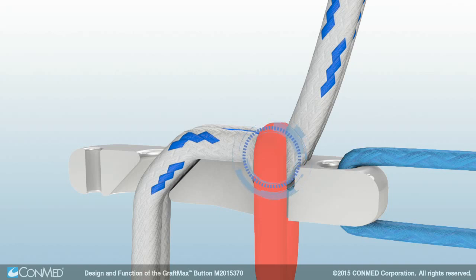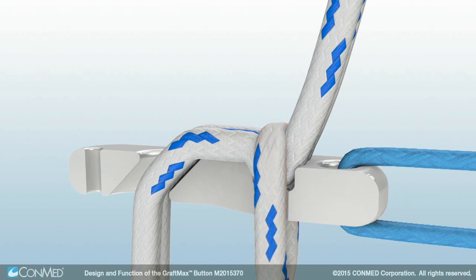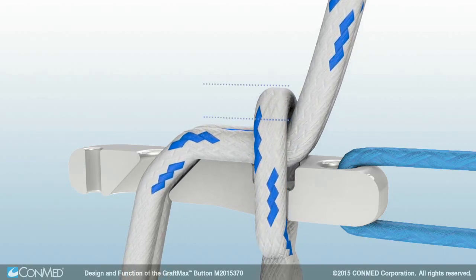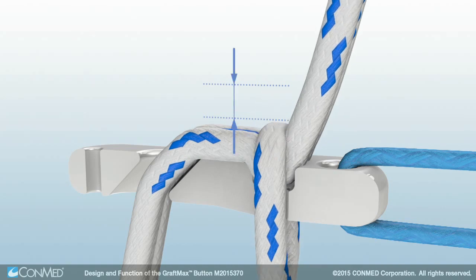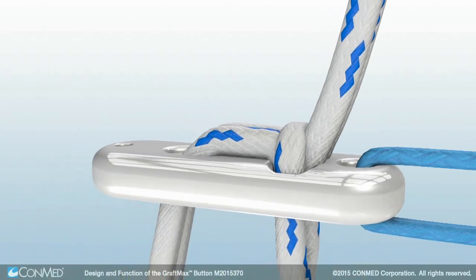Mechanical fixation is created by the locking loop applying a direct force to the suture tails, compressing and securing the tails into the locking pocket. During initial tension of the graft, the locking loop compresses down into the locking pocket and may travel approximately 2-3 mm as it secures the suture tails. This locking loop travel is confirmation that the GraftMax button is fully locked.